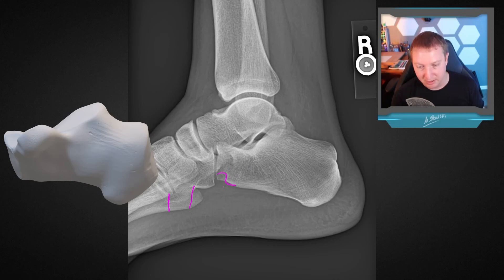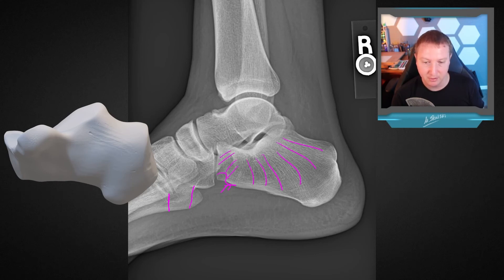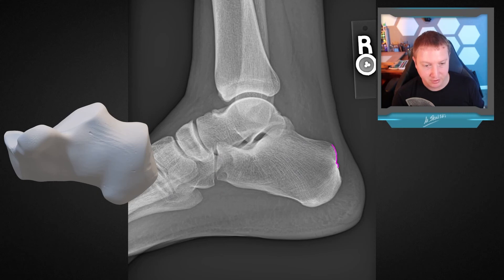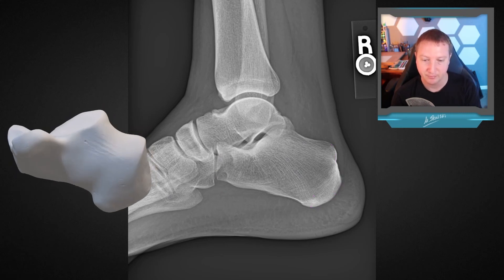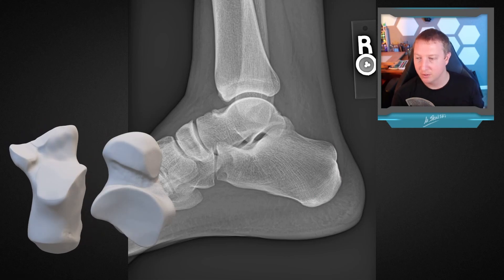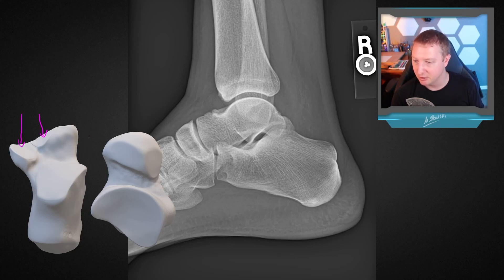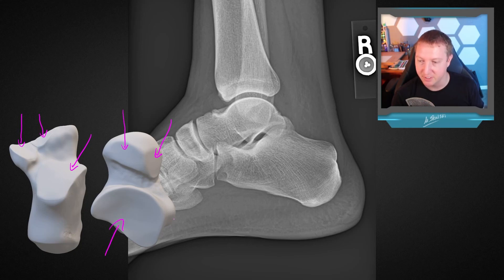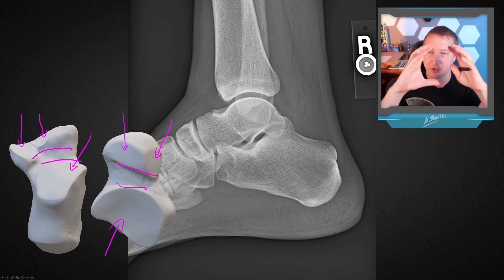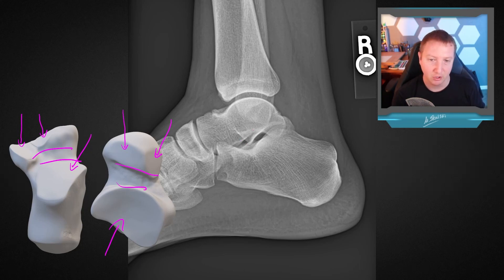We can see the calcaneal tubercle contour and again notice the fan-shaped arrangement of the primary trabecular pattern coming out from the subtalar joint. We can see all three facets nicely here: the smooth portion, the Achilles attachment site, and the weight-bearing portion. On the subtalar joint, there's the anterior facet, the middle or sustentacular facet, and the large posterior facet — matching up with the anterior facet, sustentacular facet, and posterior facet on the undersurface of the talus. There's a groove forming a circular structure called the sinus tarsi region.